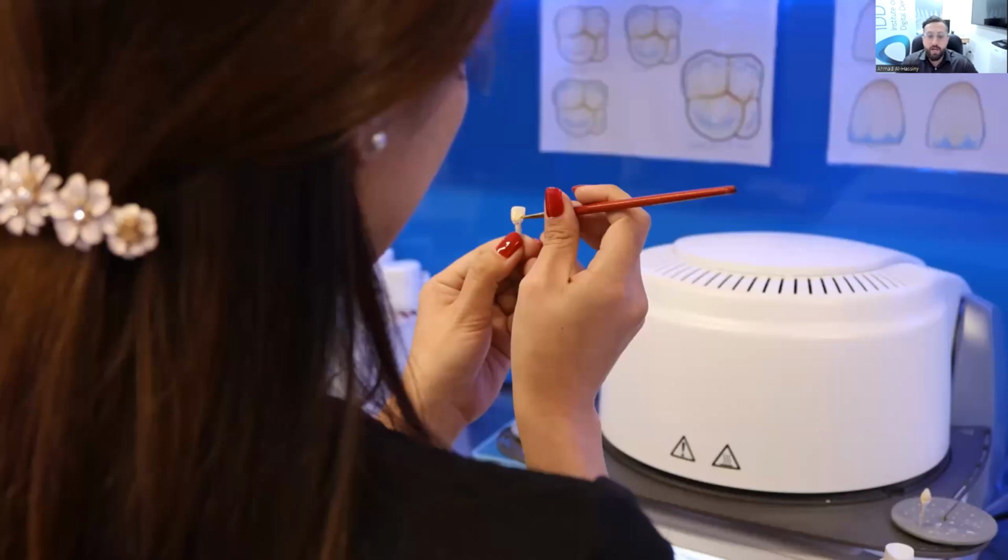This is what I was mentioning about material processing. This is my DA Blanche. And for a lot of the CADCAM work in-house, she actually does a lot of the staining and glazing for me. And I post a lot of my work on my Instagram, the same day crowns that I do. And believe it or not, that DA is doing most of the staining and glazing. And if you want to check it out, I think you'll be blown away, because it looks amazing. It really does. It's something you can be proud of. And these are all things you can offload to the team, train the team, upskill them, because this frees you up. And by freeing yourself up, this is an increase in ROI, because you can do other things in the practice, like see more patients.